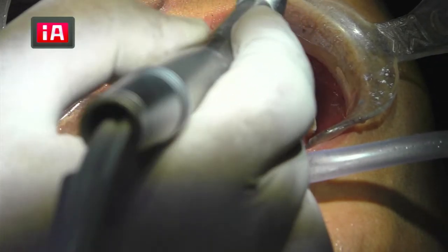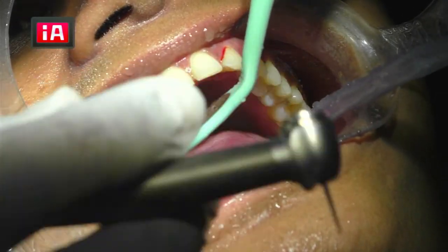And here the sharp angle, I'll slightly blunt it, so that the veneer won't get stressed in the area where it may not be stressed. Okay, slightly blunt it. Not too much, slightly, so that they can recreate that. It is done.